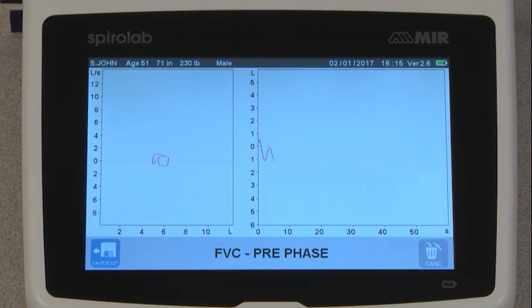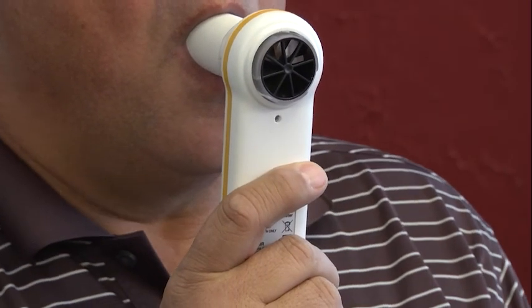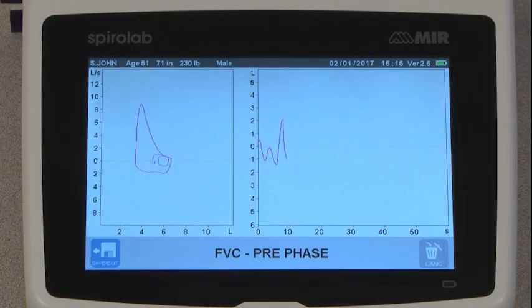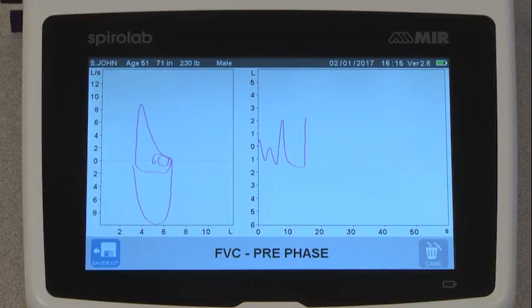Then they will take a deep breath, filling their lungs completely, and then exhale all the air in their lungs as fast, as hard, and as long as they can. When they cannot exhale anymore, they will hear a beep telling them to take a deep and complete breath in.